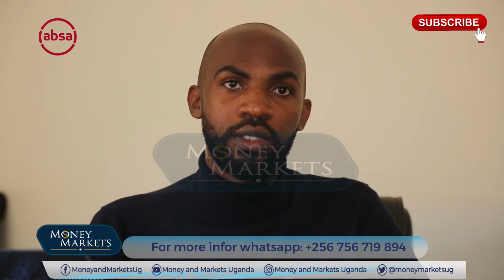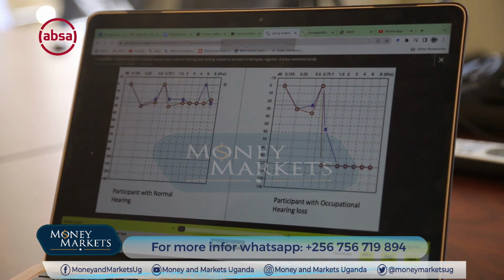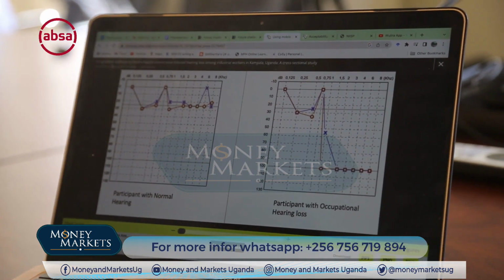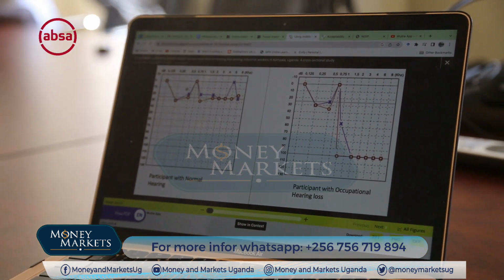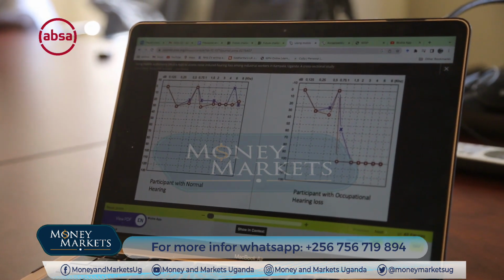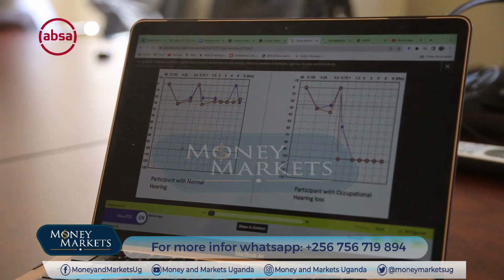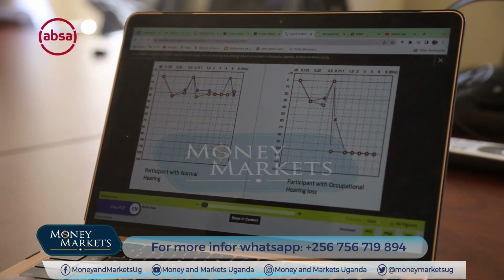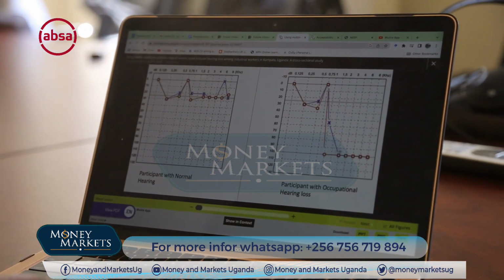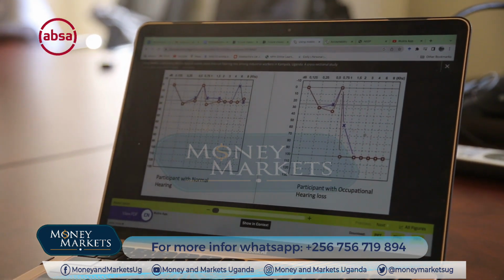As the test is conducted, the first thing that we do is to get the baseline values, or the baseline frequencies that you can listen to. After getting the baseline frequencies, the audiologist makes various adjustments depending on the guidelines available, as you respond as to whether you have heard the sound or not. When you have heard the sound, press OK, then they will go to either a lower frequency or a higher frequency to assess for either high frequency or low frequency hearing loss.